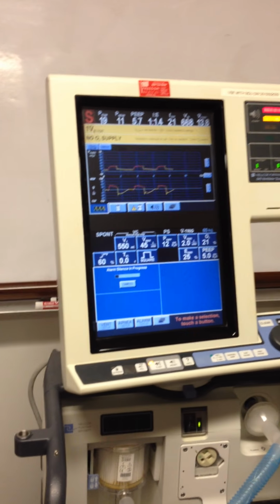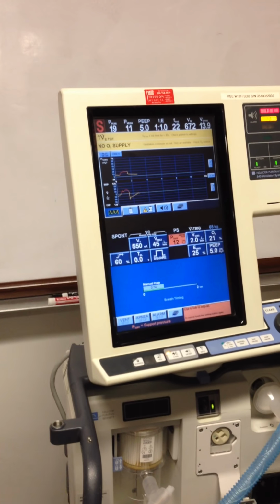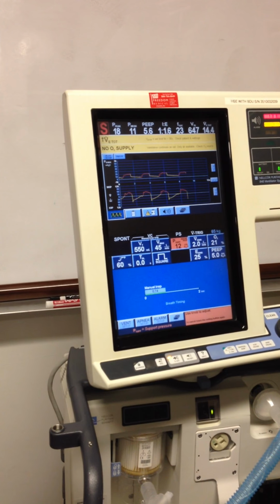Yeah, so now we're at 18, 19, but if he gives us the change of the delta P as like 15, then that should be 10. 15. That would be 15. All right.